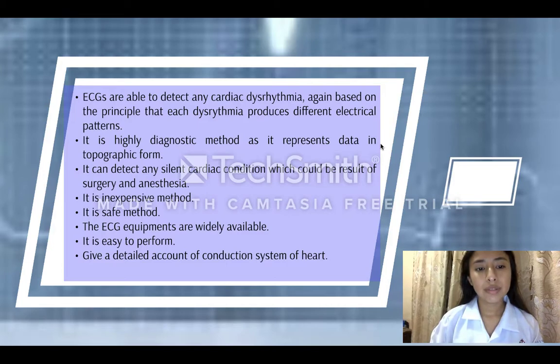It is an inexpensive method. It is a safe method. The ECG equipment is widely available. It is easy to perform and gives a detailed account of the conduction system of the heart.